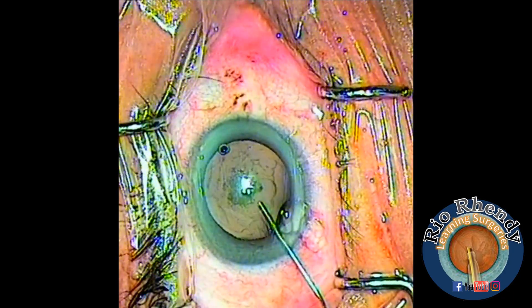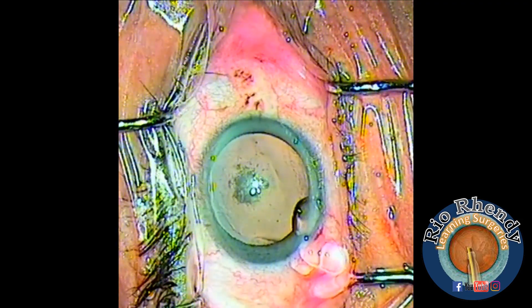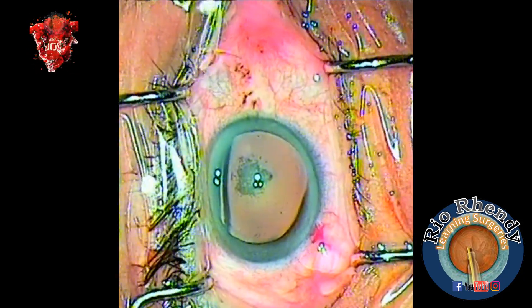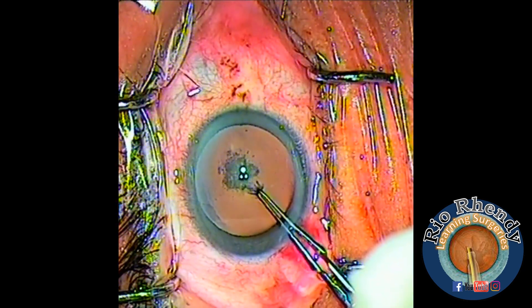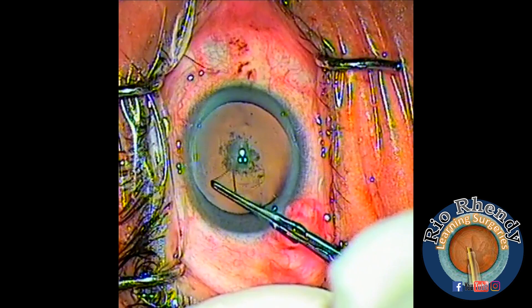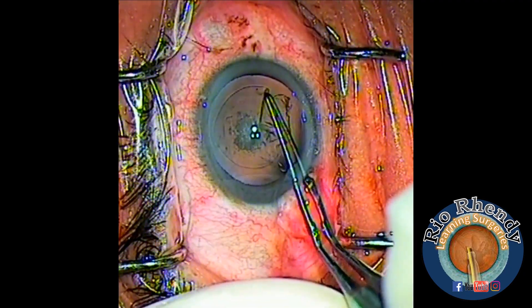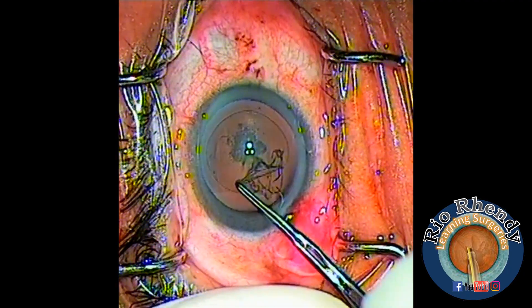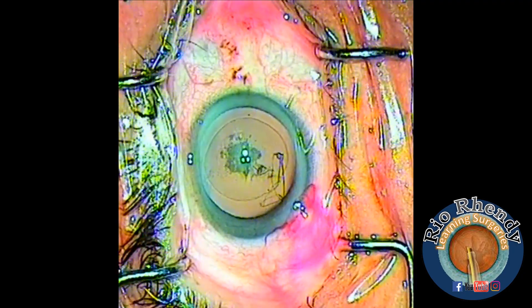Now I put a little bit of OVD — this is sodium hyaluronate — it's best for maintaining the anterior chamber. Now I'm starting the capsulorhexis. I'm using forceps, making a tag, holding the tag, and moving all around the anterior capsule just near the pupil.